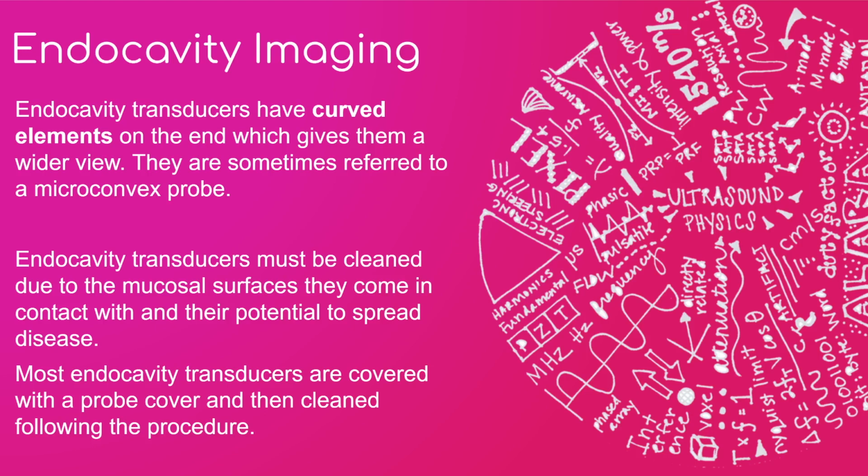So how we clean our transvaginal or our transrectal transducers is usually in-house in the department. We'll first wipe them down with alcohol wipes, and then we wipe them down again with kind of like a bio wipe. It gets rid of some of the biological material. And then lastly, you are going to use a chemical liquid that will highly disinfect the transducer, and that's called glutaraldehyde, or Cidex is the one that you might hear when you're out and about. Or the big one now that most labs are using is called a Trophon unit that uses aerosolized hydrogen peroxide to warm it up, and it gets kind of sprayed, misted over this whole thing, and it works fantastic. It's a really nice tool to disinfect our transducers.